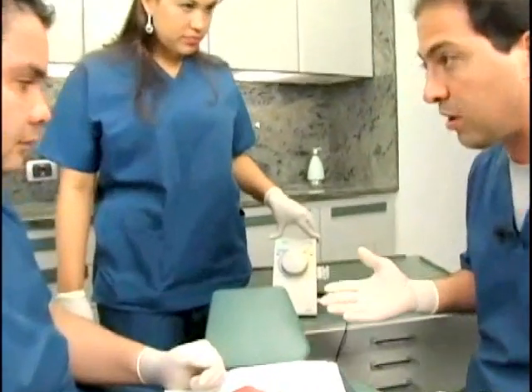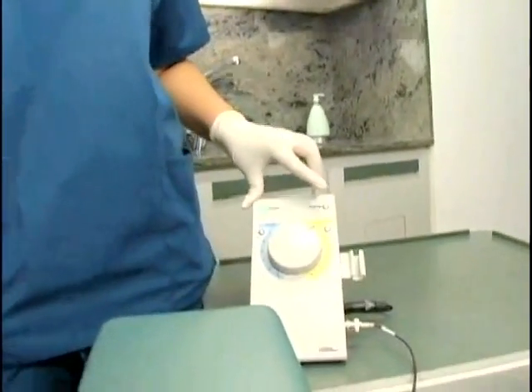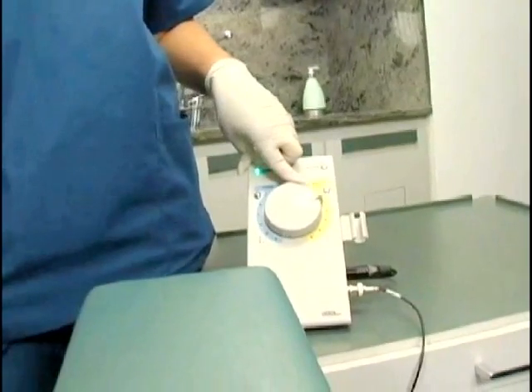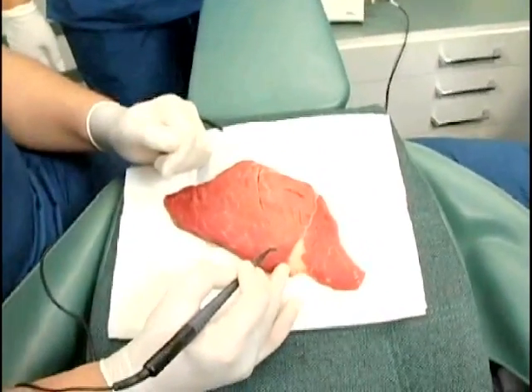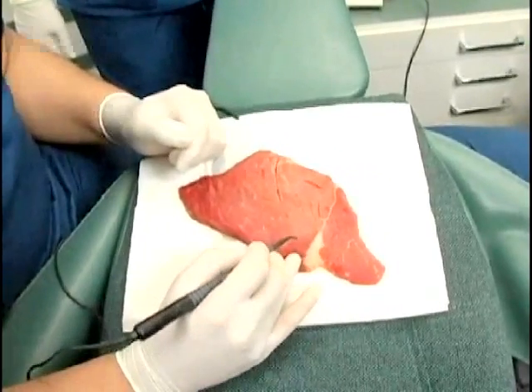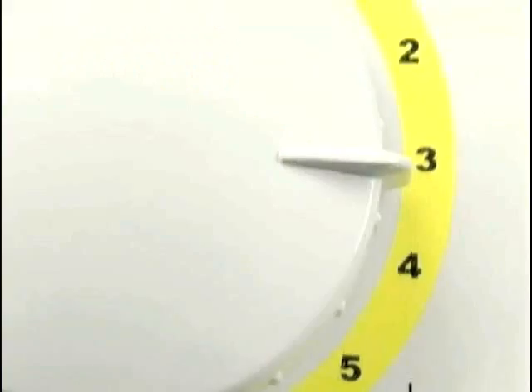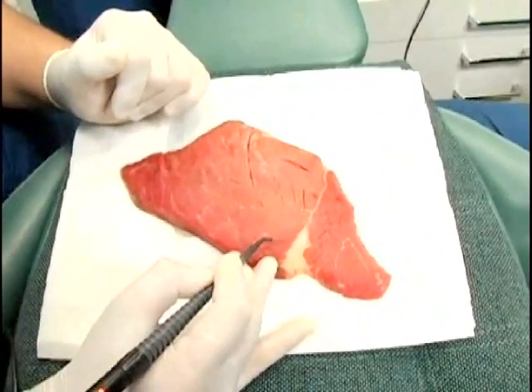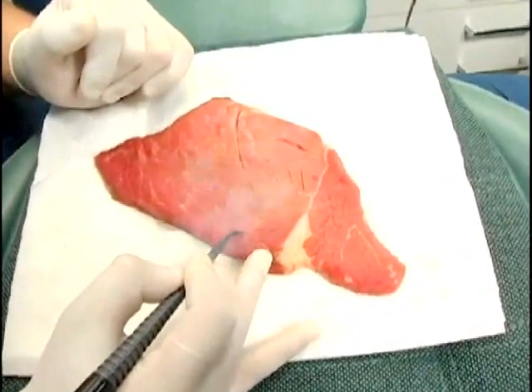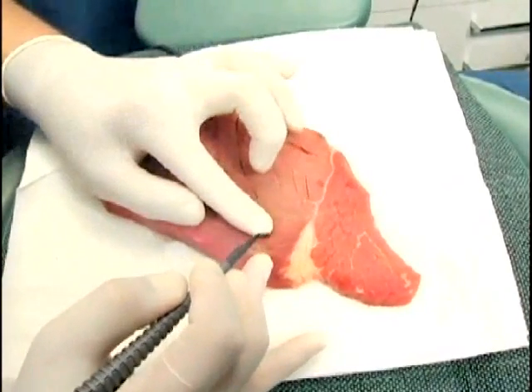It is important that you take into consideration a finger rest and the proper brush-like motion. A lower setting will guarantee a clean cut. Once we use the right amount of power, the result is a clean and precise cut.